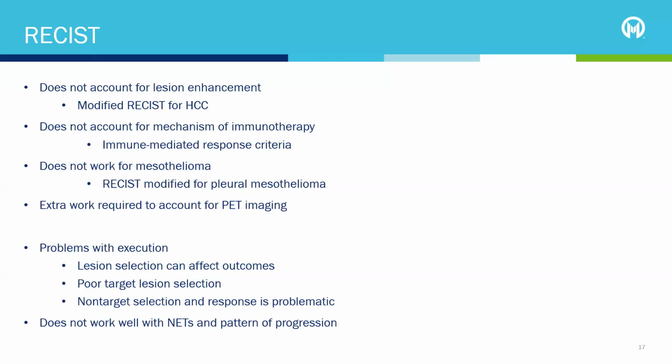Many times that medicine, or maybe it's just little beads, blocks the blood flow to the tumor. So there's no blood flow to the tumor, or the tumor is dead, and so it's not enhancing anymore. It doesn't have that hypervascular appearance. Maybe when we image, all that enhancement is gone, but the size hasn't changed that much. That can happen, particularly depending on the time interval you get it. And so by RECIST, the response would be 0. Size hasn't changed, response is 0.